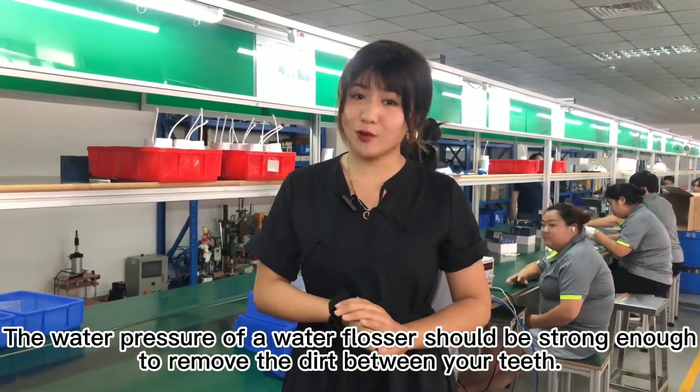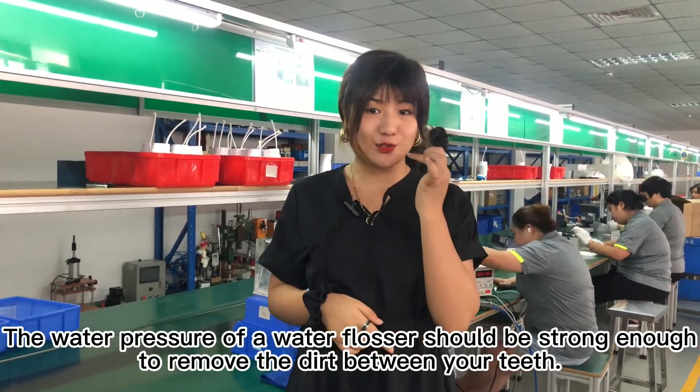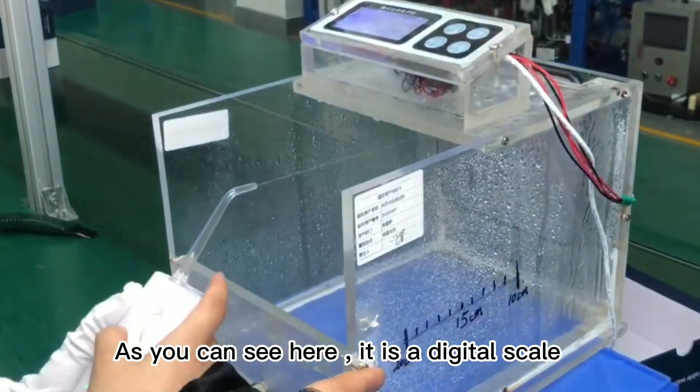The water pressure of a water flosser should be strong enough to remove the dirt between your teeth. So this workstation is for water pressure inspection. As you can see here, it is a digital gauge.